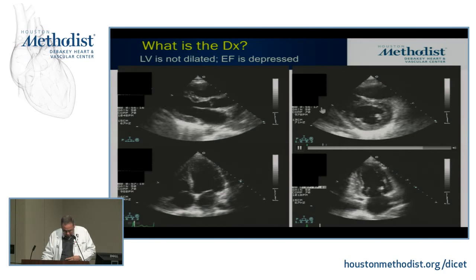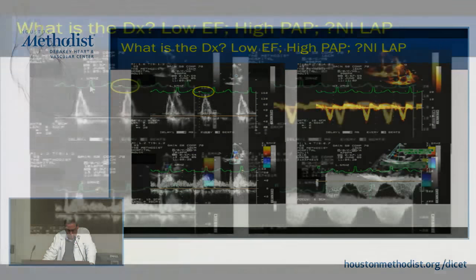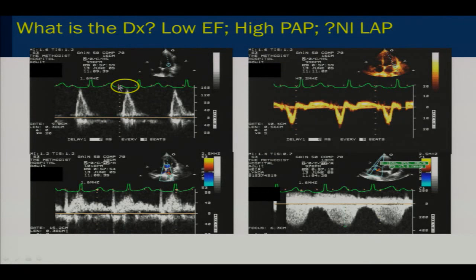So the biggest clue is not in the echo, it's right here, okay? And the biggest clue is that this patient has a very long PR interval, okay? So this is not an E wave, this is a summation EA wave. So diastology goes down the drain because this is not an E prime, this is a summation EA prime. So the patient probably has diastolic dysfunction just because he has an abnormal myocardium, but you cannot say much about diastole here.